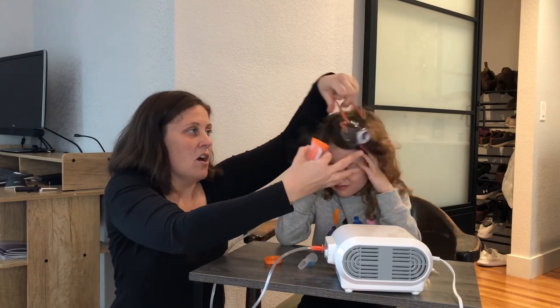Pretty easy to take on and off. The mask in particular is for kids, and then we also have an adult size mask as well.